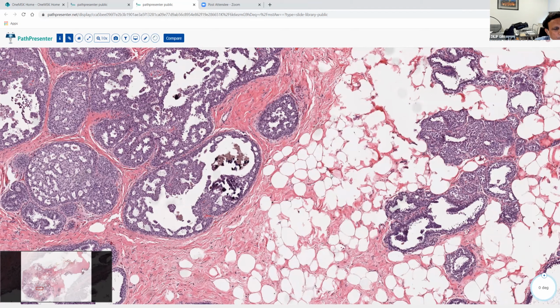Using such words, collide and all, probably may not be a very scientific way of talking about it, because this may be an example of a cell differentiating in two different lineages, right from the word go. So they share a pathway, right? There is a low grade pathway.